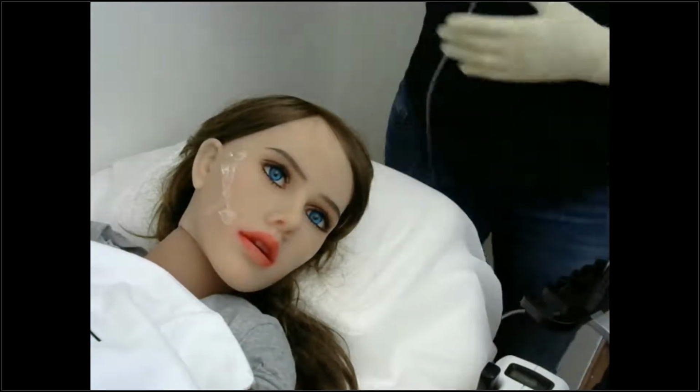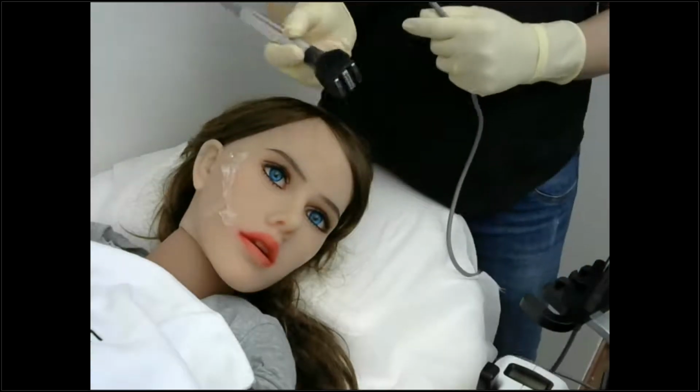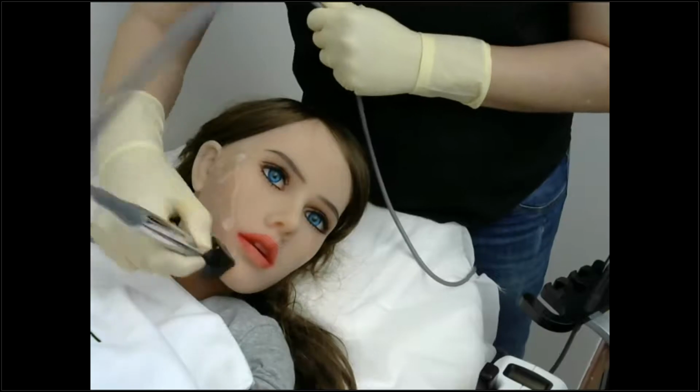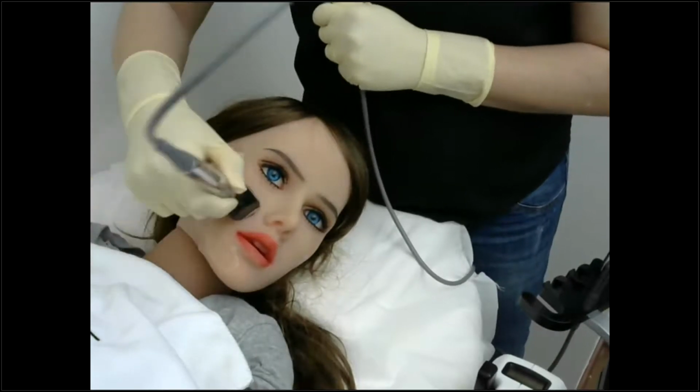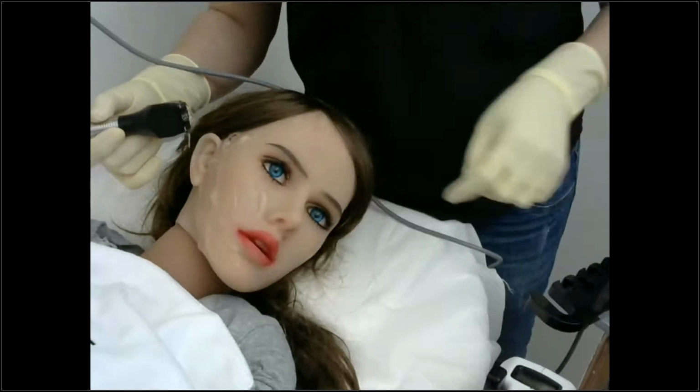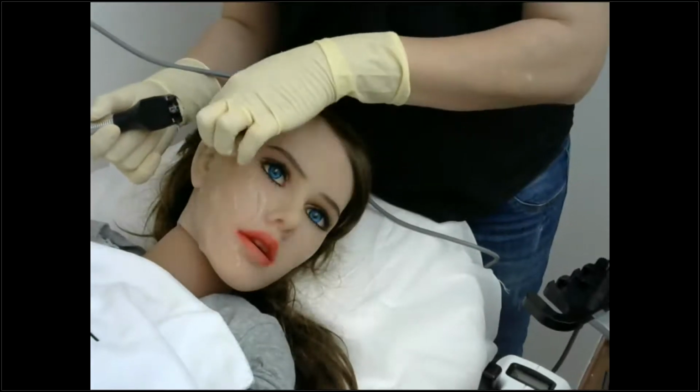And what I do just before starting the treatment is I spread the gel over the treatment area. And as I said, I apply a little bit of gel on the adjacent area as well. And you remember that is my treatment zone.